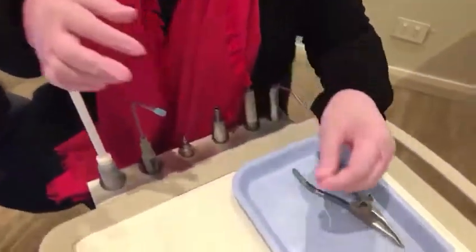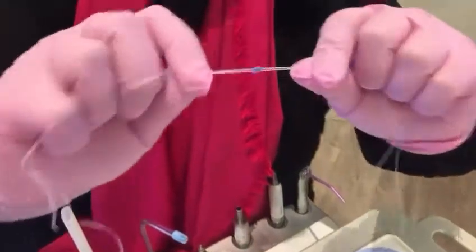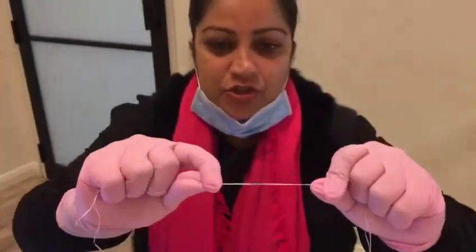I'm going to show you two ways of doing the separator. One is just looping over a long stranded floss. I love this method because you can control the stretch of the spacer — it doesn't have to stretch too much.